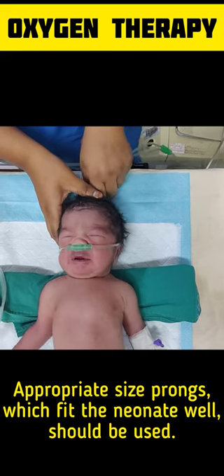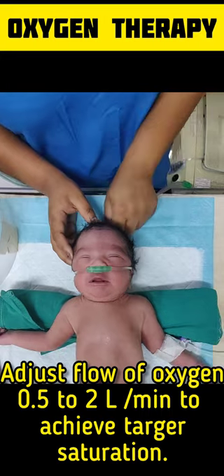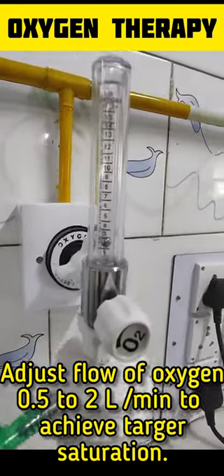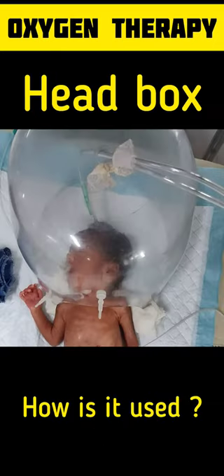Then adjust the flow rate of oxygen to 0.5 to 2 liters per minute to achieve the target oxygen saturation through the nasal prongs. Now for the head box — how is it used?